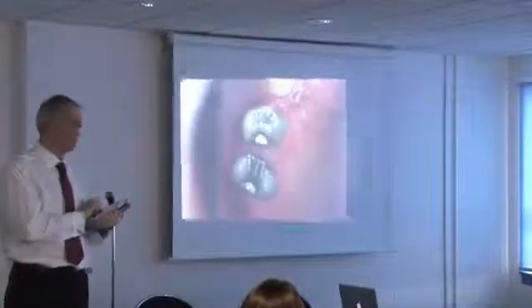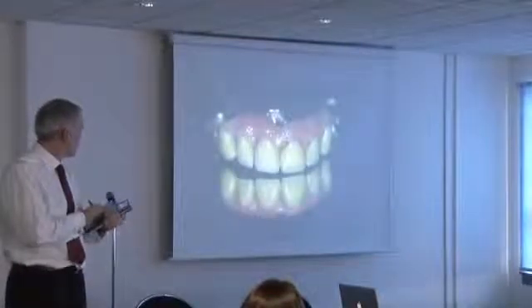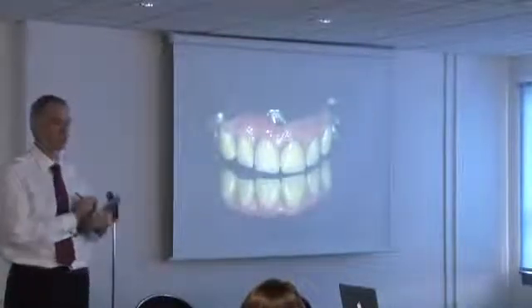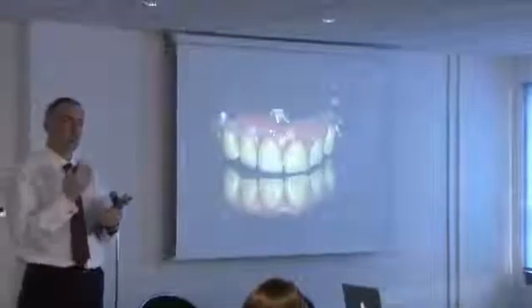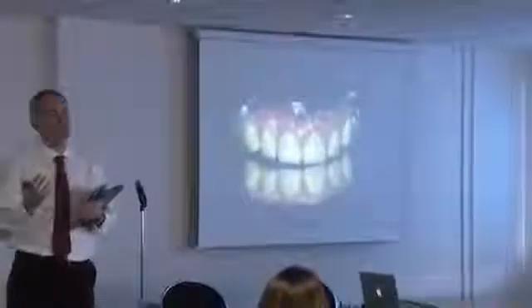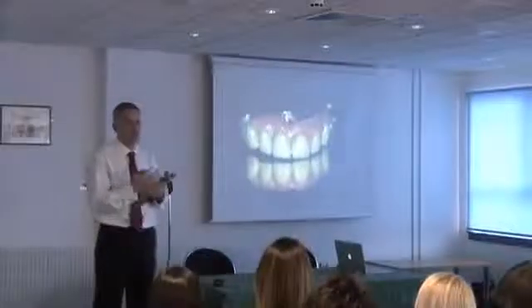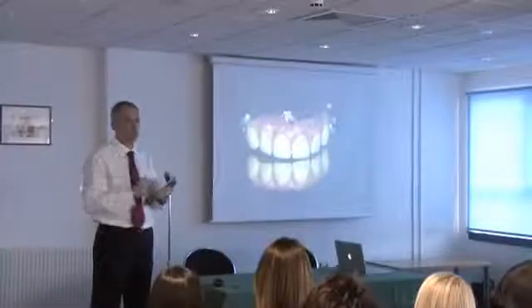I alluded to the artistic nature of denture design. Don't you just love the deep purple periodontal pocketing? This patient wanted something very natural. She was very, very embarrassed about her teeth. She did not want straight white teeth because she knew that would draw even more attention to her mouth. She wanted something that people wouldn't know as a denture.